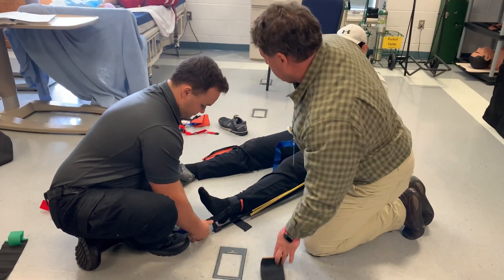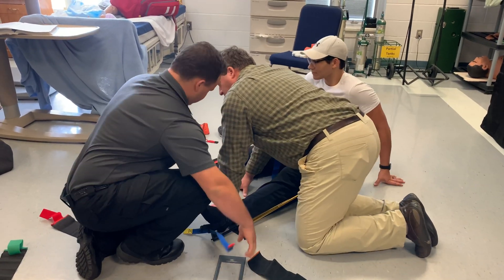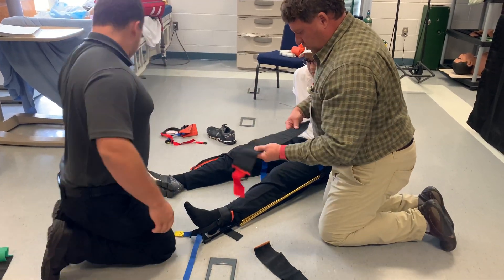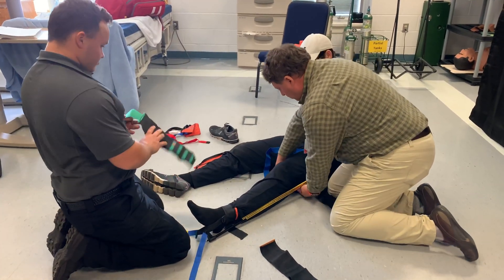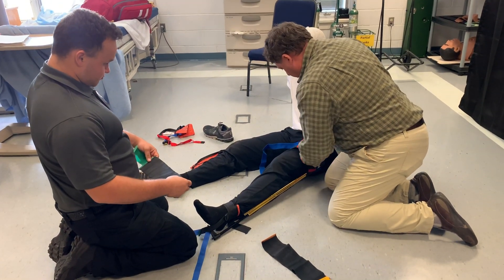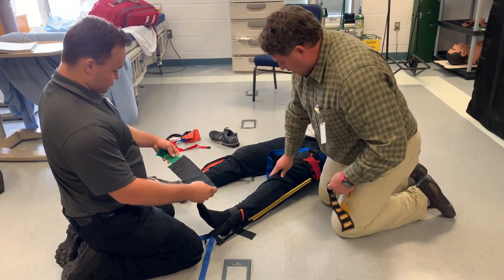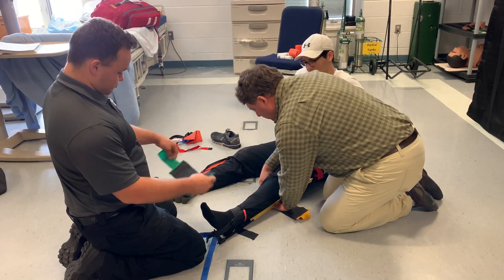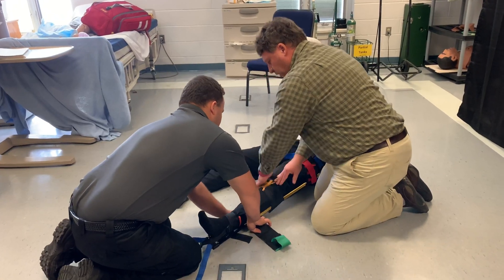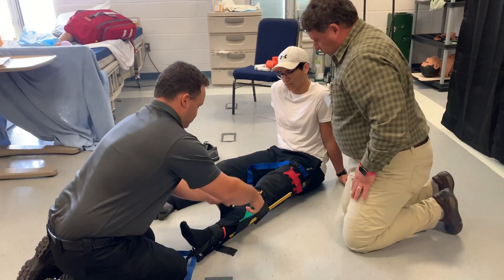At this point I have my three other straps. The red one, which is the longest, goes up — not over the fracture itself, but somewhere up here to help stabilize it. The medium one goes usually right below the knee, and then the main one, which is the shortest, goes around the ankle area to help stabilize it.